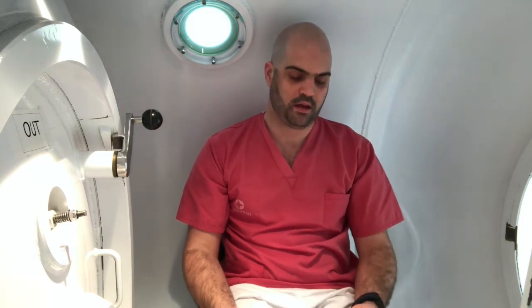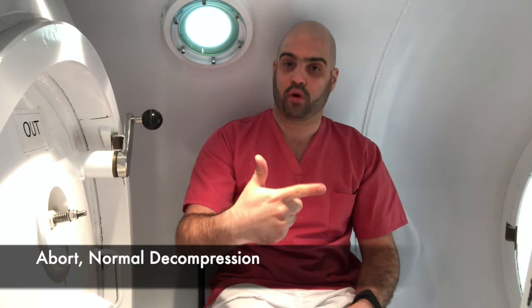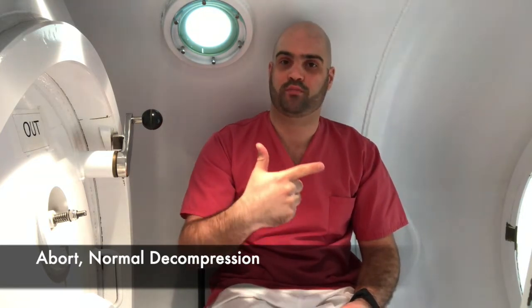Of course, we can have the situation where you need to go very quickly to the surface, or you have to abort the session, but not that fast. So you can do your safety stop, you can do your decompression stop, and you can, let's say, follow the recommendations on the ascent speed. So this is the sign for aborting any session, but with a normal decompression procedure. Okay.